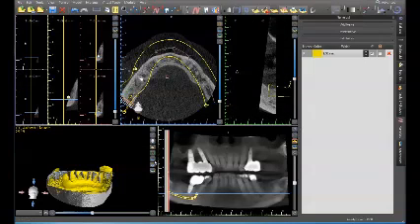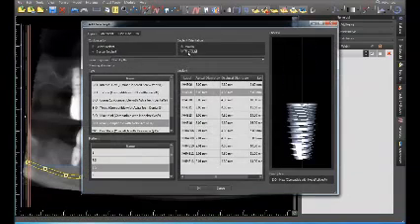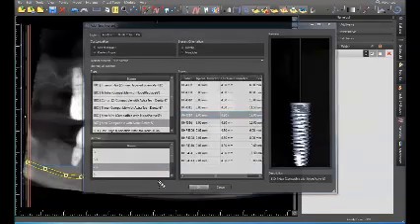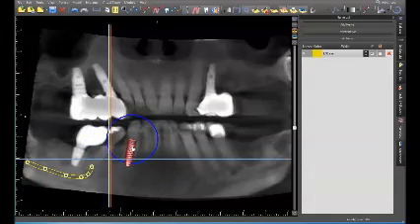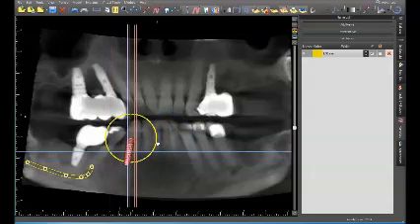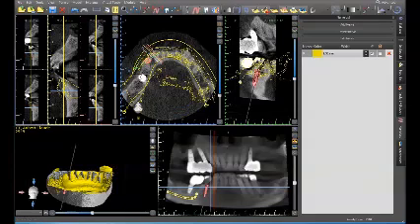So now what we want to do is add our implant. So add implant, do a mandibular implant, 4.3 preferably. I'm thinking around 11 or 13 is where I'll end up. And then I kind of want to place this in an ideal scenario in line with this canine tooth. Just a little cant of that. So I'll probably place somewhere like this. Let's look at it in other views.